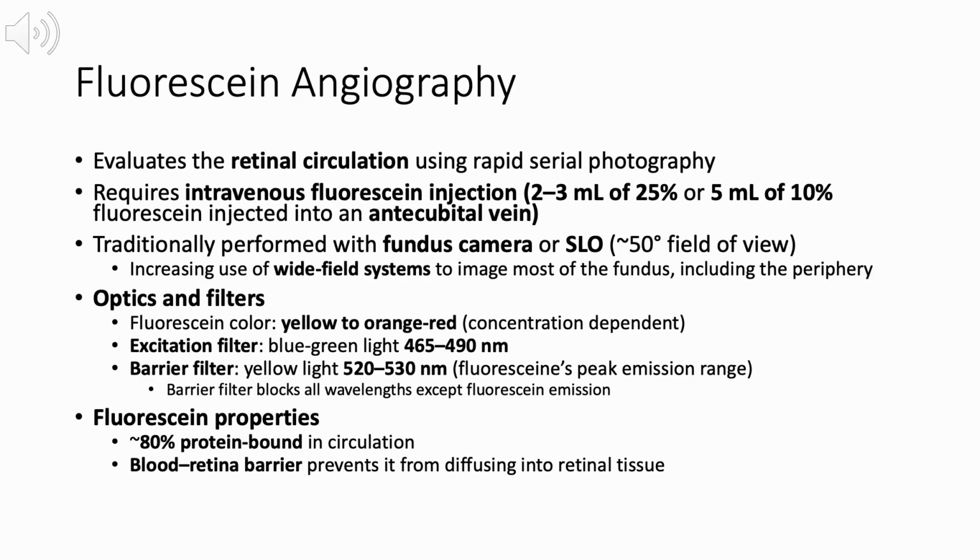Transitioning from non-invasive imaging modalities to dye-based vascular studies, fluorescein angiography, or FA, is crucial in ophthalmology for visualizing retinal blood flow, diagnosing and monitoring conditions like diabetic retinopathy, macular degeneration, and vascular occlusions, and guiding treatment by showing leaks, blockages, or neovascularization that other imaging, like OCT, might miss, revealing the dynamics and integrity of retinal and choroidal circulation.